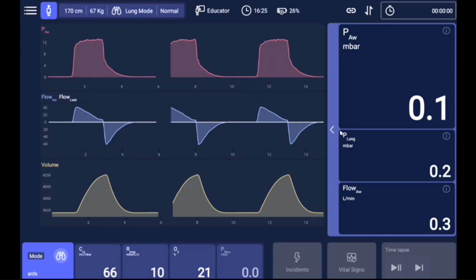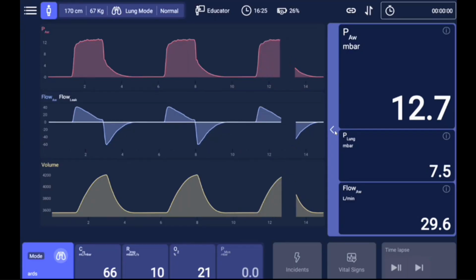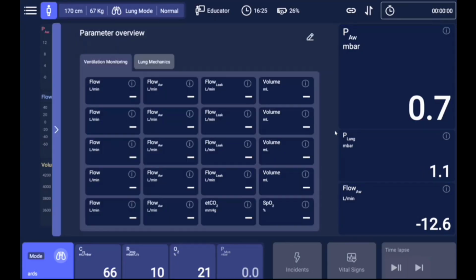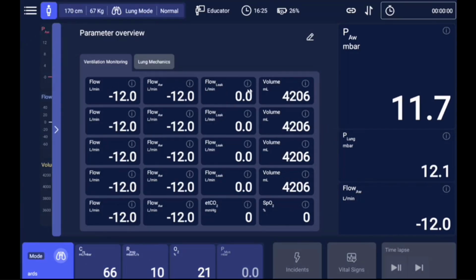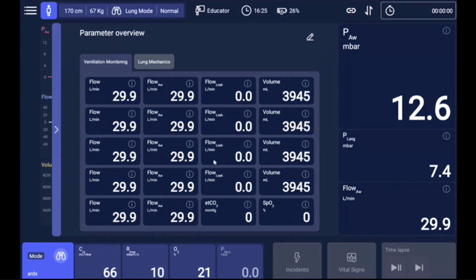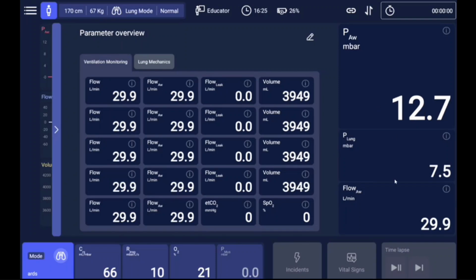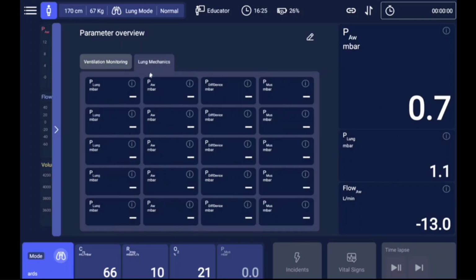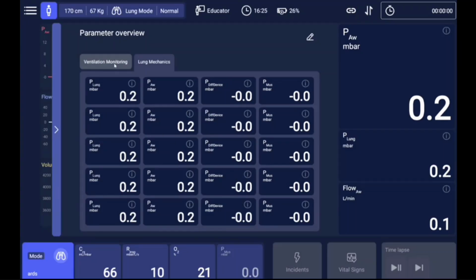We haven't implemented all of the monitoring values, but at the end, I think we end up with 35 monitoring values about simulation, also ventilation parameters and patient parameters. So you see them all here when you open this tab. You can look at the parameters, and you can also configure them in the main monitoring area. You also will have certain lung parameters like resistance and compliance. They will also be shown as a monitoring value.